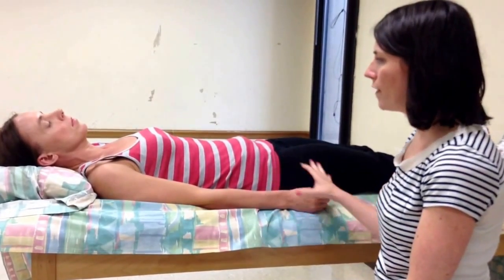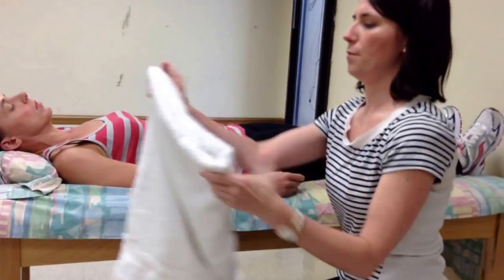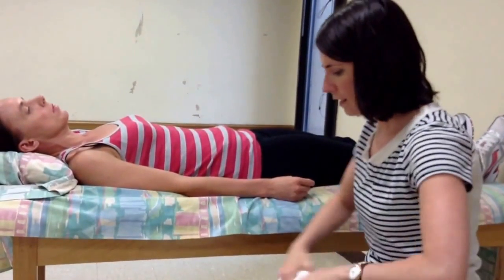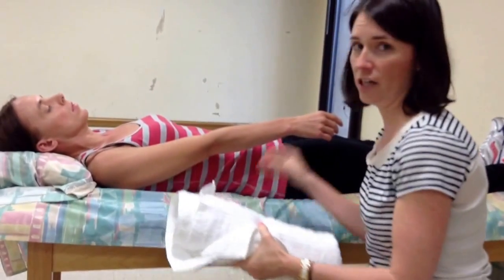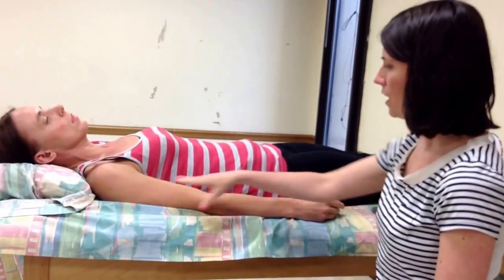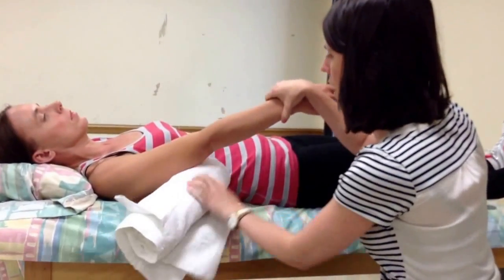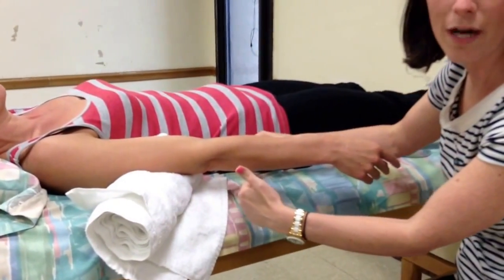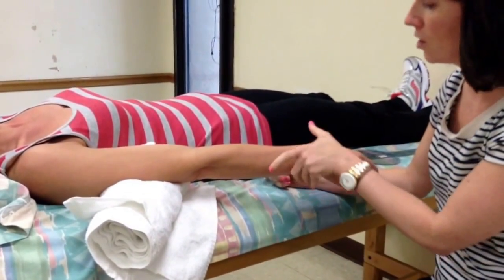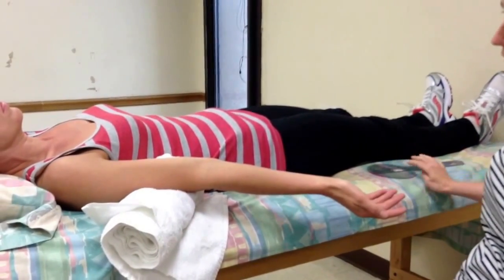Our patient is supine on the bed and we need to take a little towel roll and place it underneath her distal humerus so that if she has any hyperextension of the elbow, we're going to catch it. If we don't put a towel roll underneath her humerus, the bed eliminates her ability to demonstrate if she has hyperextension or not. The towel roll should not cross the distal humerus, otherwise it will limit the amount of elbow extension that can occur. We also want the patient in full supination — palm up to the ceiling.